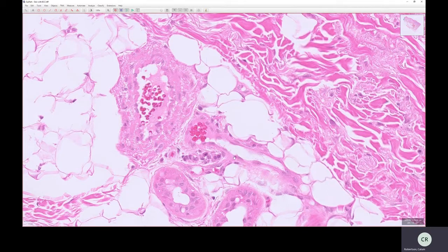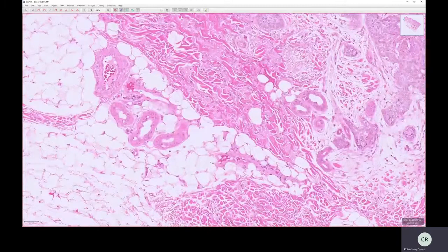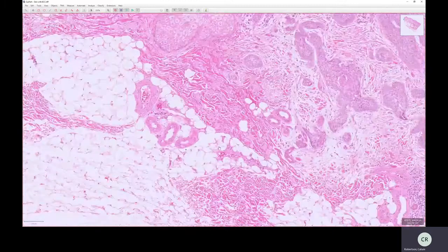These are the nuclei I'm pointing out because they're stained with hematoxylin. But either side of the nuclei, you can see some pink cytoplasm. These are forming tight junctions to seal off the lumen of the vessel, to keep all the intravascular components inside here, not spilling out. And then the wall is composed of smooth muscle cells and other cells. We're going to go into this in more detail a bit later, but suffice it to say, these are blood vessels. That'll do for the moment.